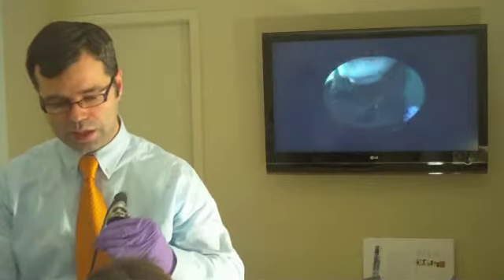With nasal endoscopy, I use a rigid nasal endoscope, and it's inserted in the nasal passages. And what this allows me to do is to evaluate the structure of the nose and the anatomy of the nose, and look at the nasal septum and turbinates. I can look for a septal deviation or enlarged turbinates. It also would allow us to see a tumor or mass inside of the nose, and to evaluate people for nasal polyps.